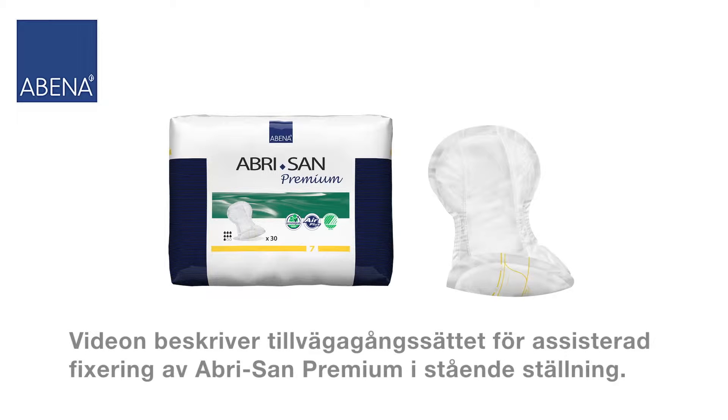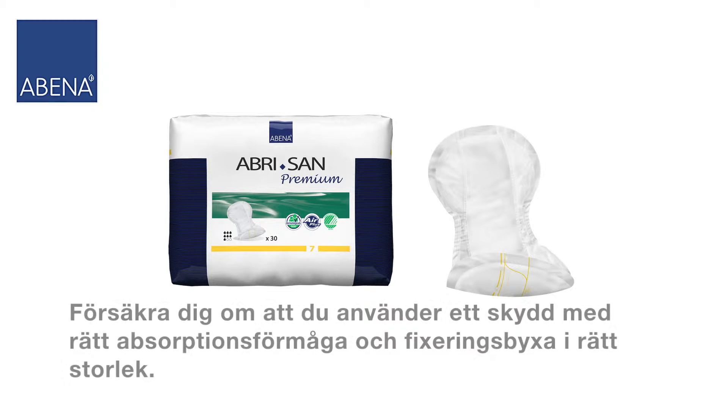This video describes the assisted Abri-San application in a standing position. Please ensure you select a pad with appropriate absorbency and a fitting pant in the right size.